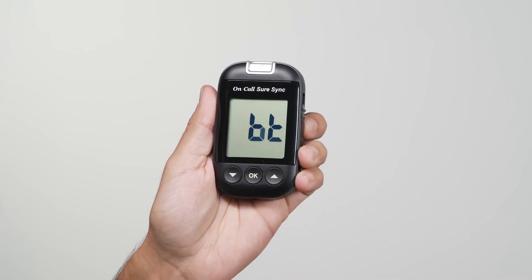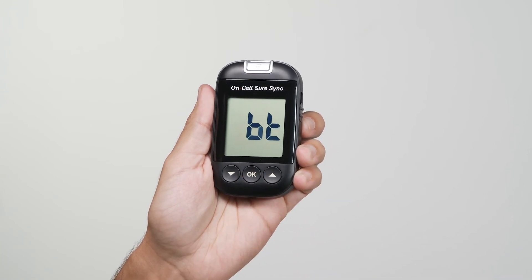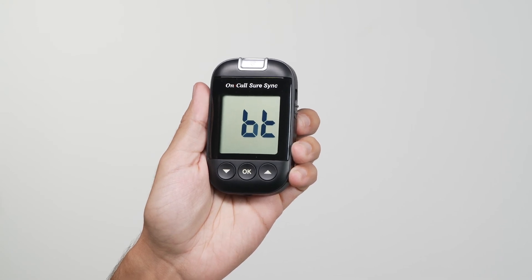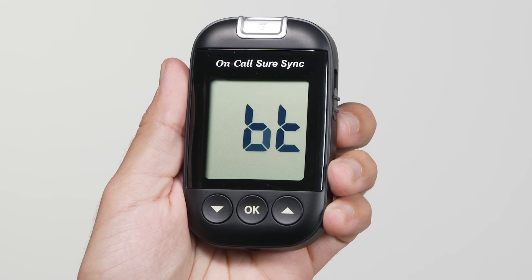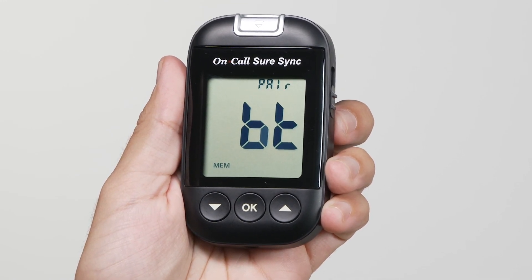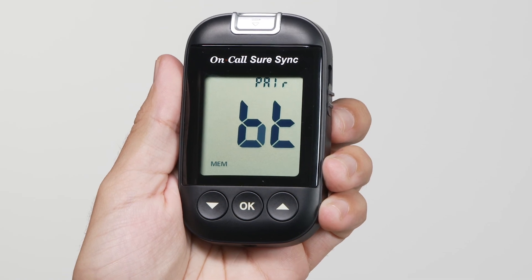In pairing mode, BT displays along with the word pair blinking at the top of the display to indicate the meter is attempting to connect with the mobile device. Once the pairing is completed successfully, the word pair stops blinking and the MEM symbol displays to show that the device is paired and stored in the meter's memory.